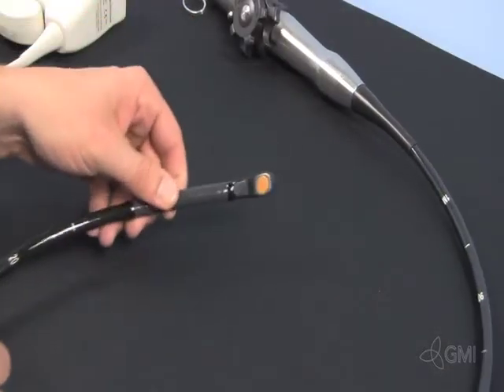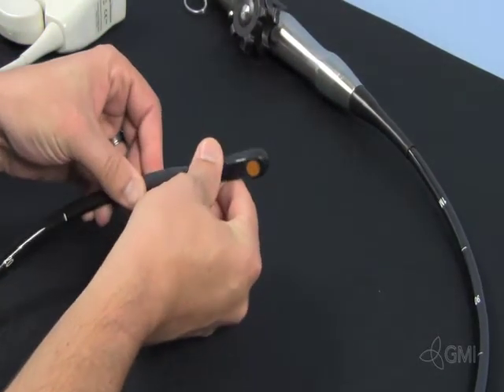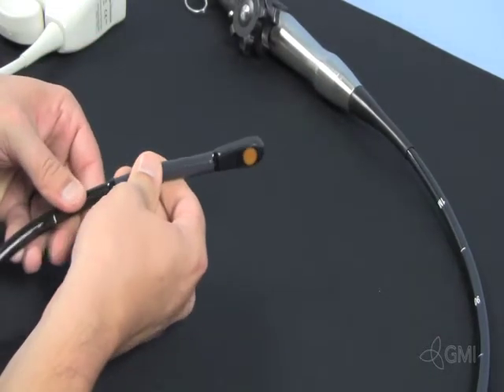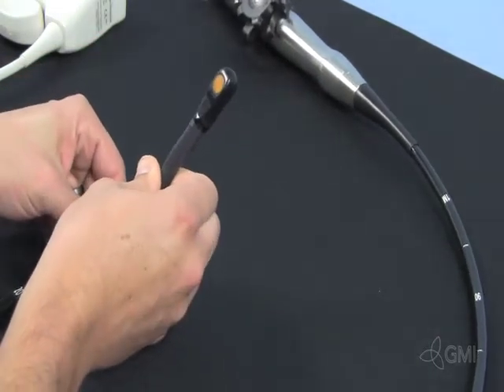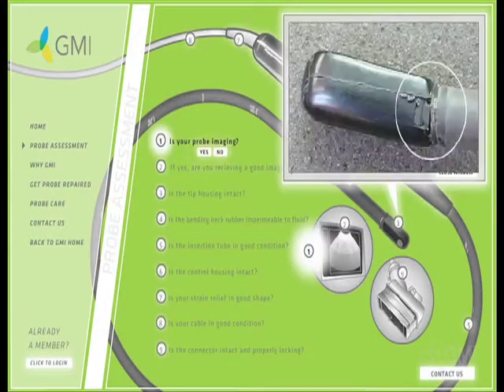After cleaning and disinfecting, a visual inspection should be completed before imaging occurs. Starting at the tip, look for cracks, cuts, and gaps in the seal. Inspect the lens for bite marks, cuts, and cracks. Also check for fluid infiltration.